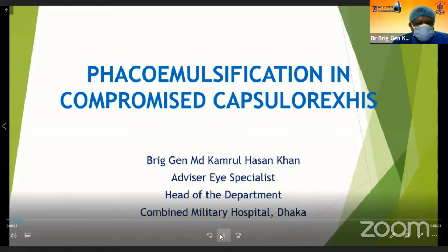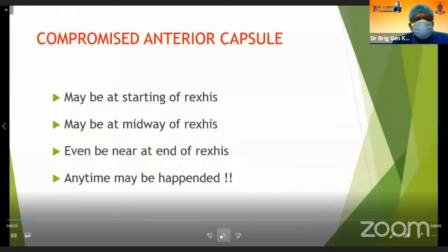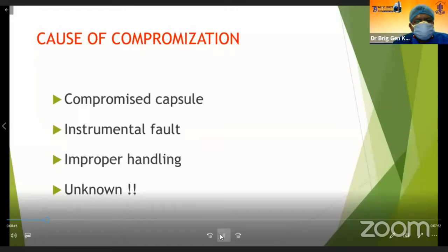Anterior capsule may be as usual smooth, fibrosed, wrinkled, plaqued, pseudoexfoliated, and there may be senility also. Compromised anterior capsule may occur at the start of the rhexis, midway, or even at the end of the rhexis. Anytime it may happen. Causes of a compromised rhexis capsule are instrumental fault, improper handling, and sometimes no reason at all.